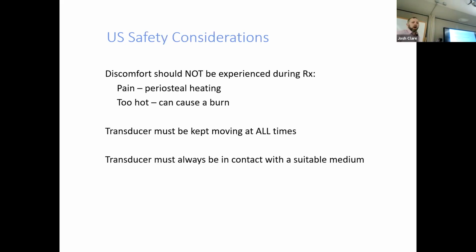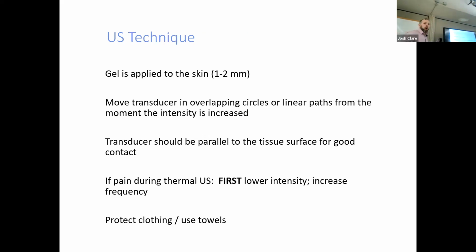Discomfort should not be experienced during the treatment. Pain, again, means we're creating too much heating, too hot, causing a burn. Keep the transducer head moving at all times. Always keep in contact with a suitable medium. So we're using this ultrasound coupling gel. We want 1 to 2 millimeters of gel between the patient and the sound head. Overlapping circles or linear paths.